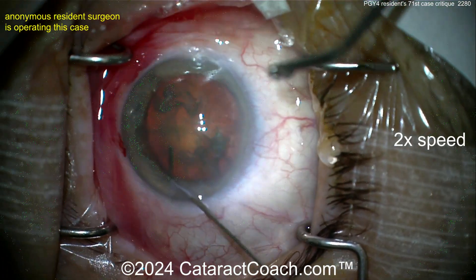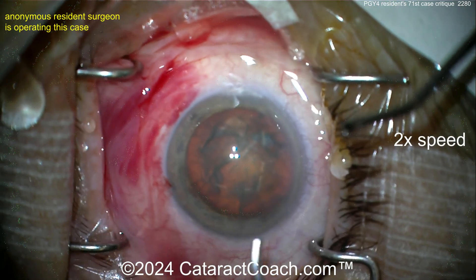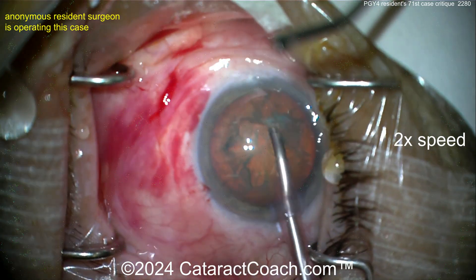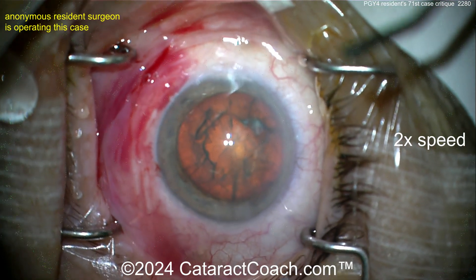This is the beginning of the PGY4 year for this young resident — this video was shot in July of the senior year. Already 71 cases done, which is pretty good. Probably another 200 or more cases in the senior year — solid training.